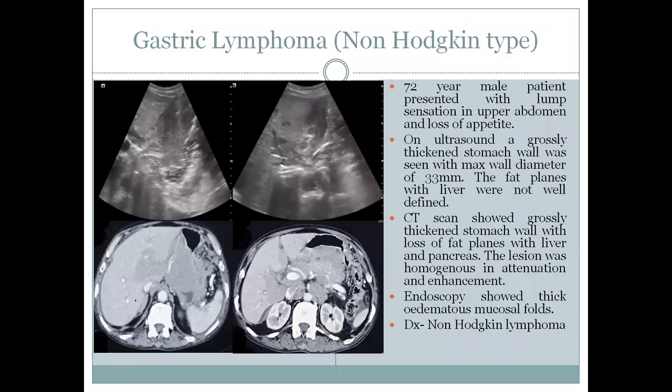A 72-year-old male patient presented with a lump sensation in the upper abdomen. Ultrasound showed a globularly thickened stomach wall with maximum diameter of 30 mm and loss of fat planes with the liver. CT scan showed globular thickening with a non-homogeneous mass.